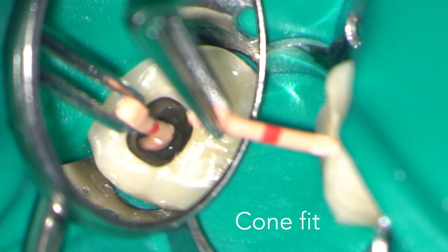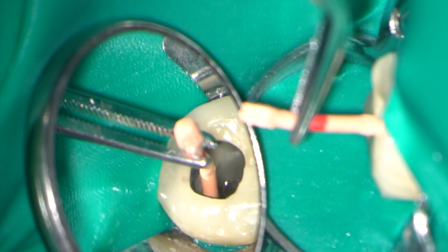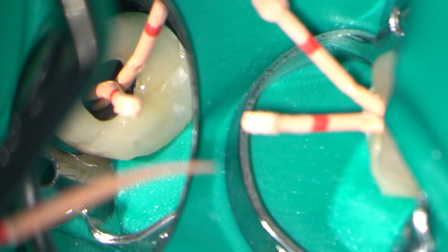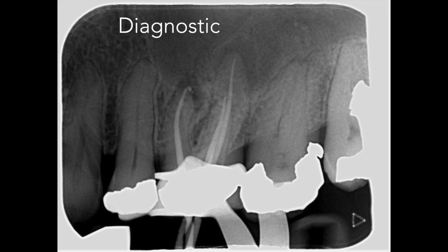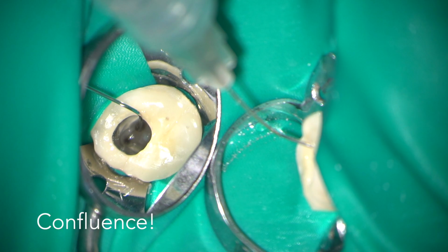I'm now doing my cone fitting through a pool of sodium hypochlorite before exposing a diagnostic radiograph. I only placed three gutta percha cones because I knew there was confluence between the pairs of canals in the buccal roots. Here you can see proof of confluence as I draw back on the syringe and the irrigant disappears from both the mesial canals.